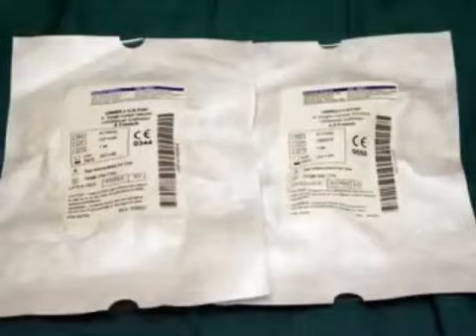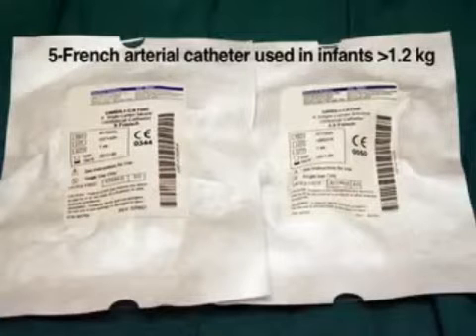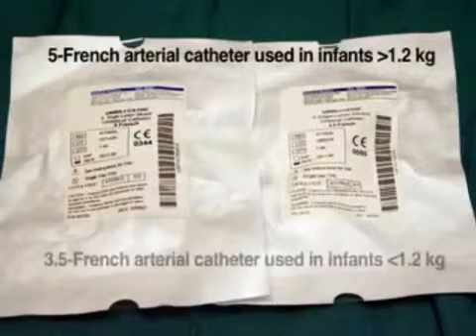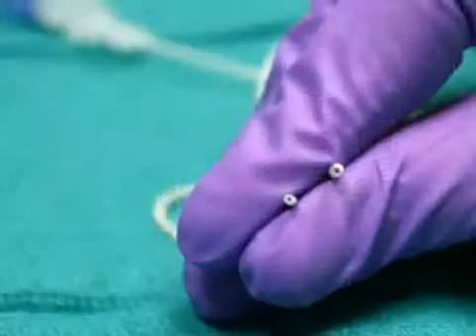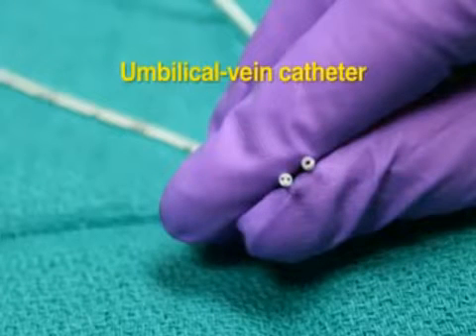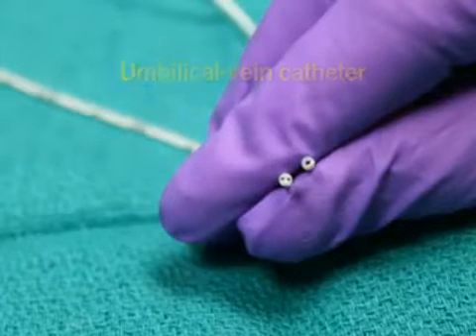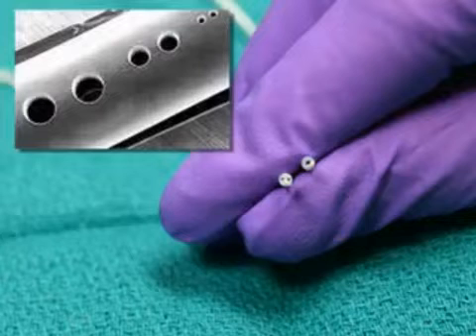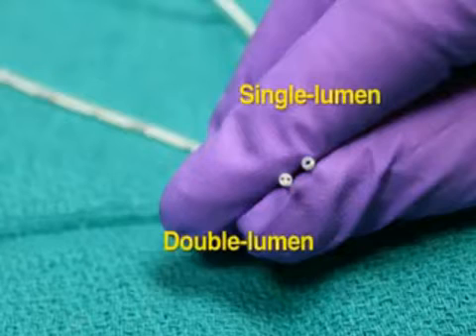There are numerous types of umbilical catheters from which to choose. A 5 French arterial catheter should be used in infants weighing more than 1.2 kilograms. A 3.5 French arterial catheter should be used in infants weighing less than 1.2 kilograms. Arterial catheters should have a single hole and be as non-thrombogenic as possible. The umbilical vein catheter should be 5 French for infants weighing less than 3.5 kilograms and 8 French for infants weighing more than 3.5 kilograms. Consider using a venous catheter with side holes when the catheter will be used for exchange transfusion. Otherwise, venous catheters can be single or double lumen and should have one hole.